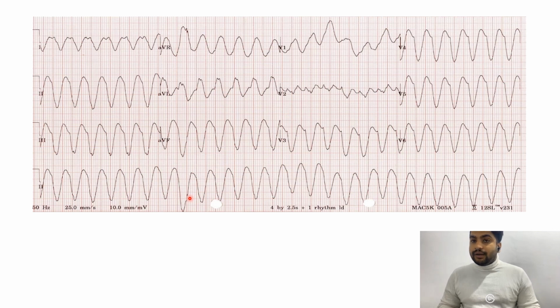So what do I mean by broad QRS complex? What is the boundary after which we call it a broad QRS complex? Well, the distance between the origin of Q wave to the end of S wave should be less than 120 milliseconds. I know this is a lot to take. You should just remember that any QRS complex that is wider than 3 small blocks is called broad QRS complex.